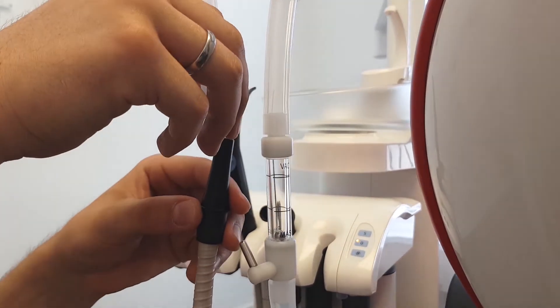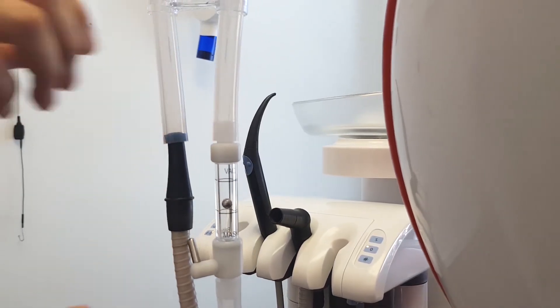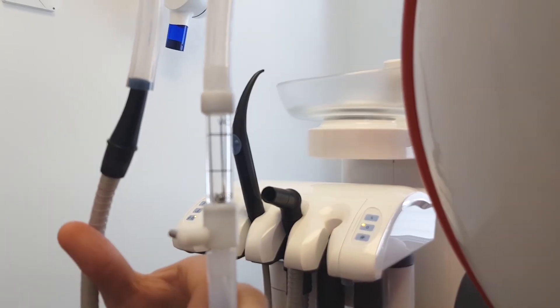Either with or without the adapter, the vacuum control block regulator lever should be adjusted so that the small metal ball hovers between the lower and upper lines shown on the vacuum control tube.